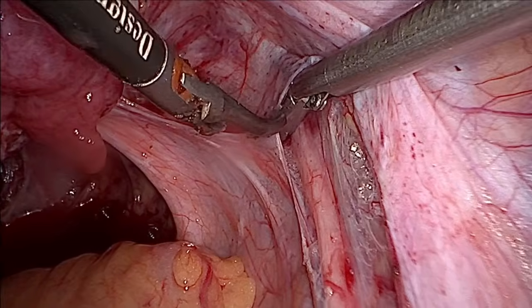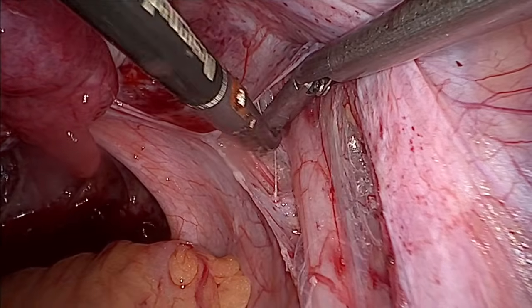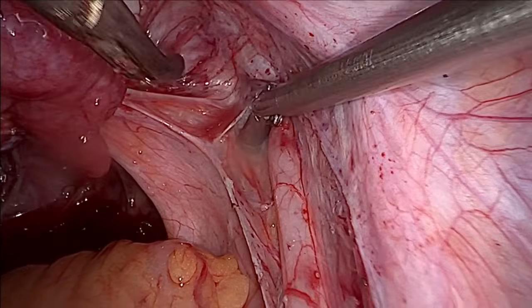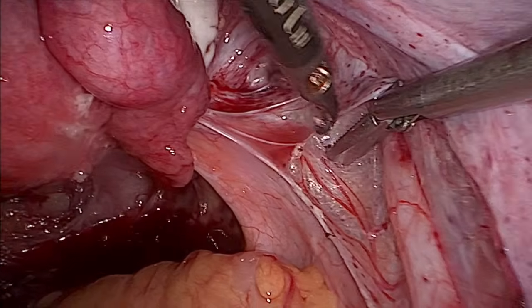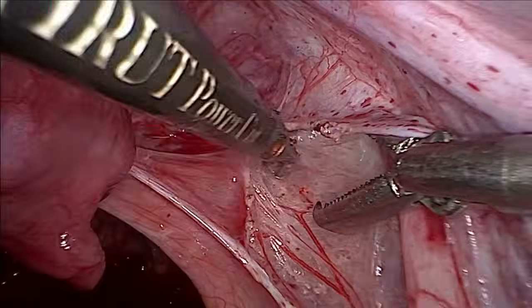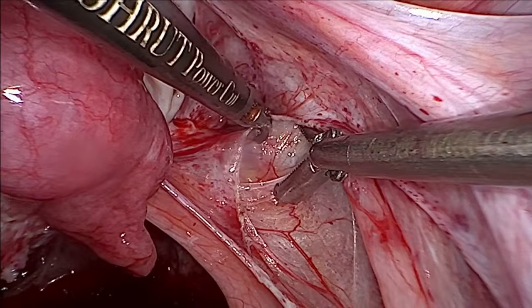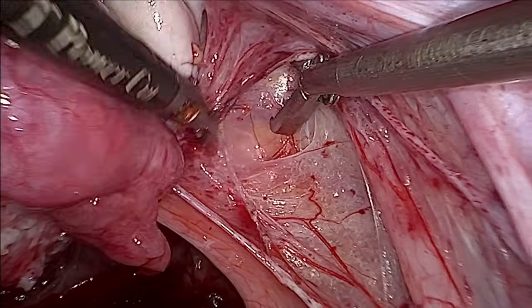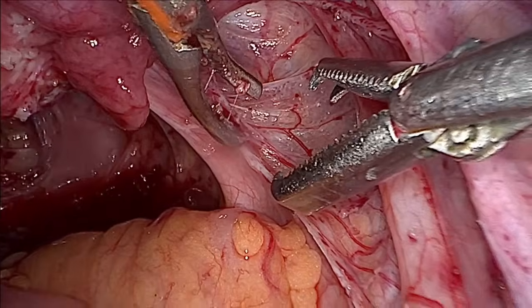Now what I have done, I put my instrument between the ureter and the peritoneum. Okay, I can just go and cut. Yeah, so now this ureter has lateralized. Okay, if you want you can just go a bit more. Okay, so now what this does, so you have this free peritoneum now.